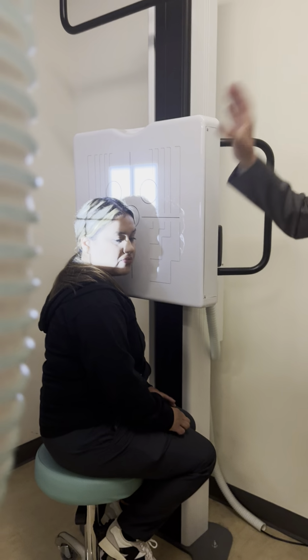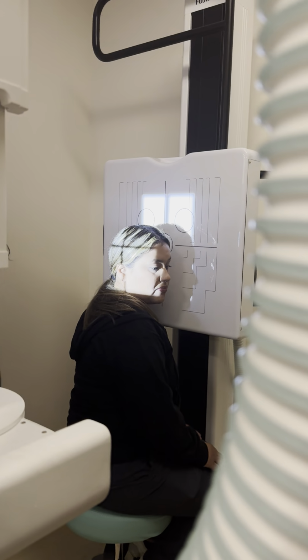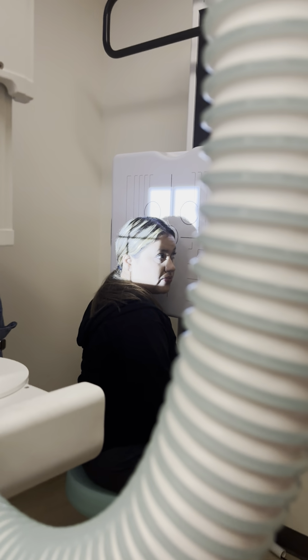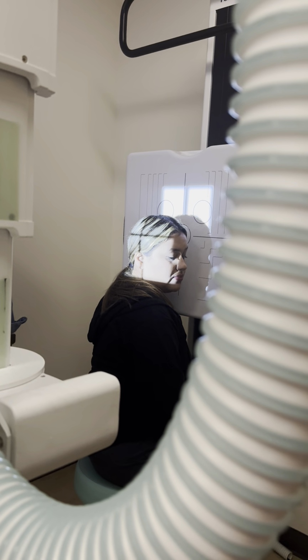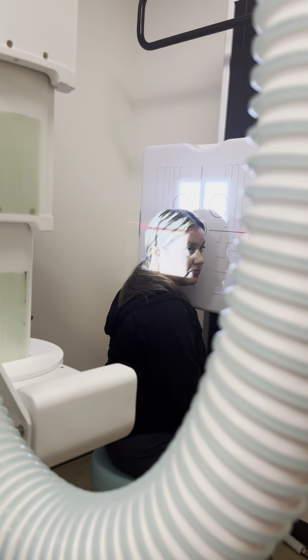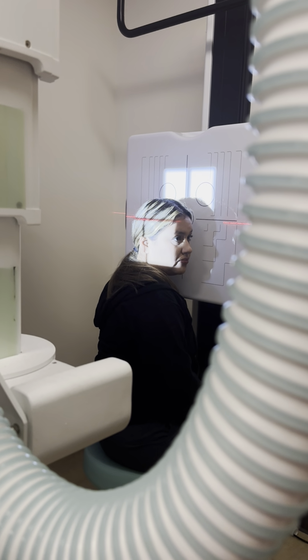So this is a lateral for the calvarium. So this is just the skull. By the time we move to the facial bones, we're gonna stay on the maxillary bone actually. So we're gonna drop it off the 2 inches right there about the infraorbital meatal line, and that's actually gonna do well for the facial. We're gonna move the patient slightly backwards for the sinuses because we're interested in the front of the face. So this is just the skull.